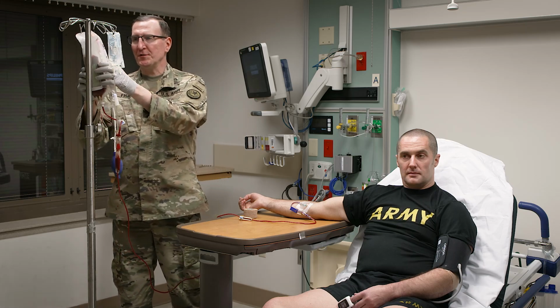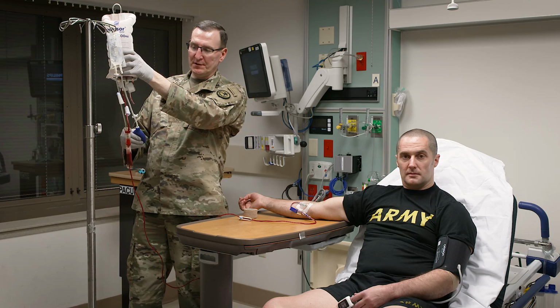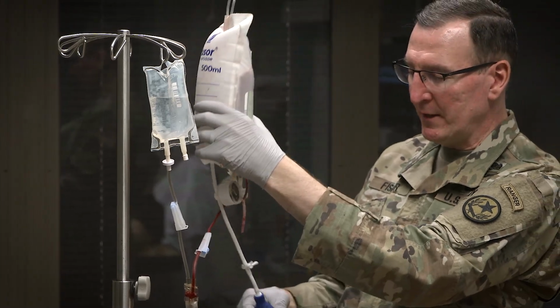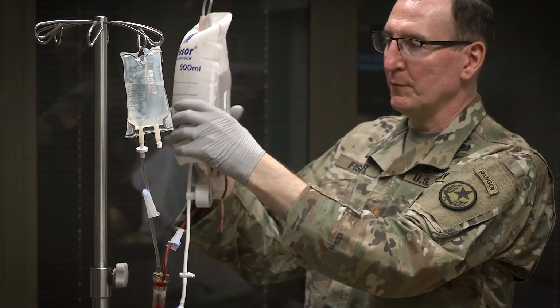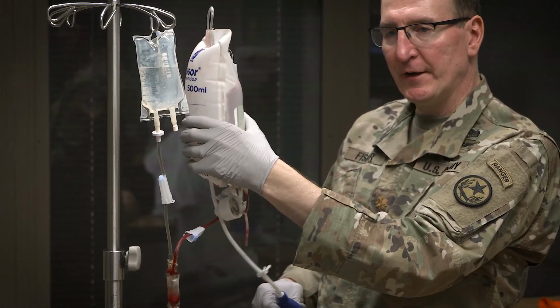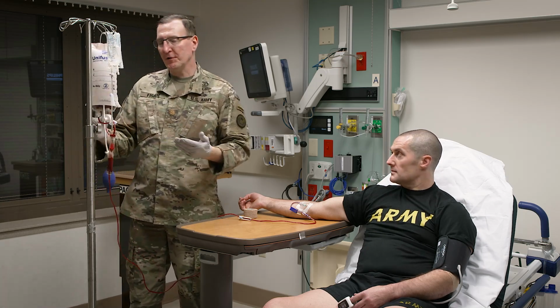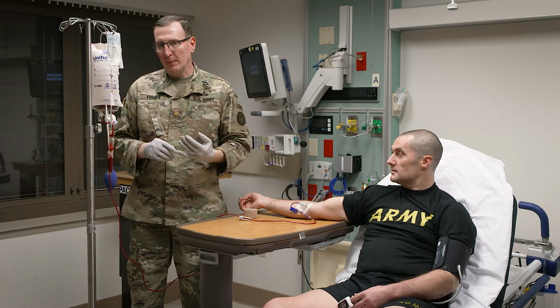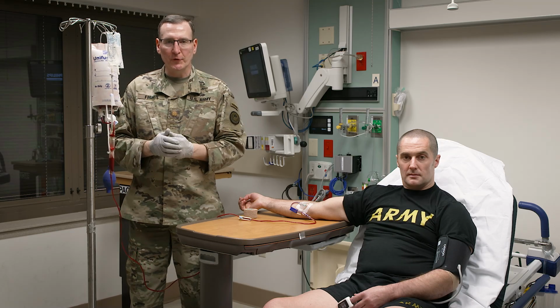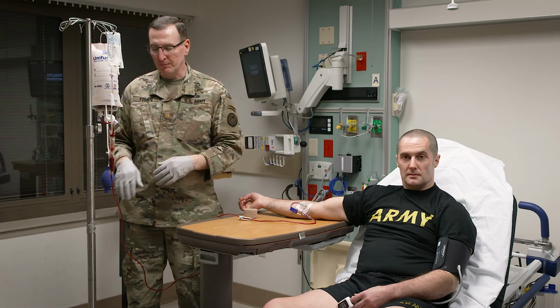Okay, so our blood transfusion is coming to an end here. We're almost complete. We're going to continue pushing and increasing the pressure on the infusion bag. And as we come close, I'm going to start preparing for what's going to happen next. So if I feel that my patient's responded appropriately and now does not require any additional blood transfusions, again, refer to the Tactical Combat Casualty Care Guidelines, to the Deployed Medicine website or the Joint Trauma System website for the most recent up-to-date guidelines and what is an indication of a successful resuscitation.